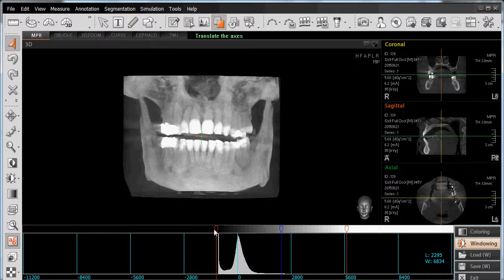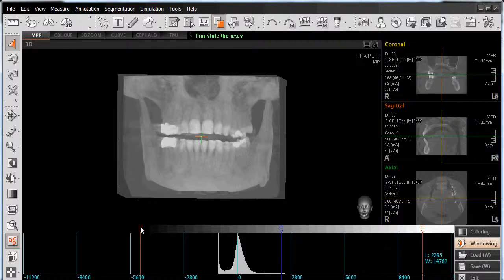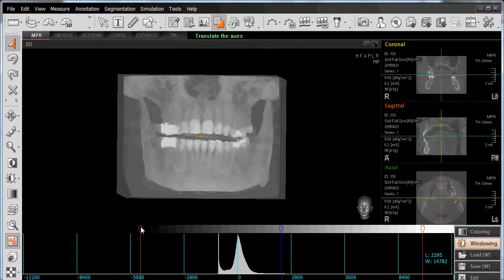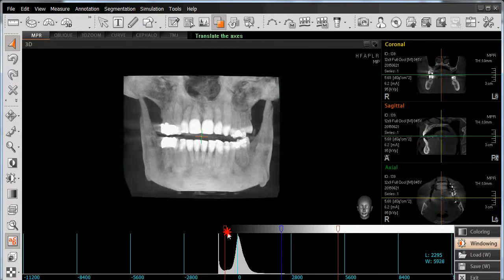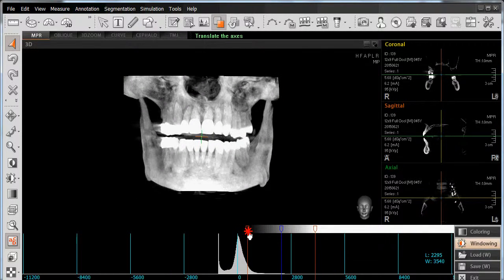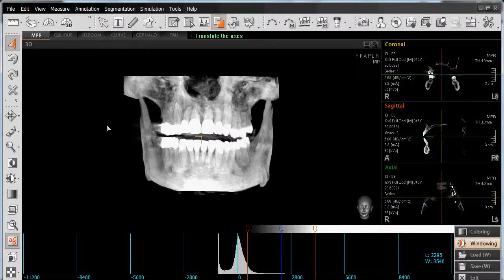As an example, if I left-click on the five-sided box for my contrast and slide it to the left, I've now reduced my contrast, or reduced the separation between light and dark. However, if I go in the other direction by left-clicking and dragging it to the right, as they converge, I'm now increasing my contrast, or increasing the separation between light and dark — in this case, filtering out the air and soft tissue.